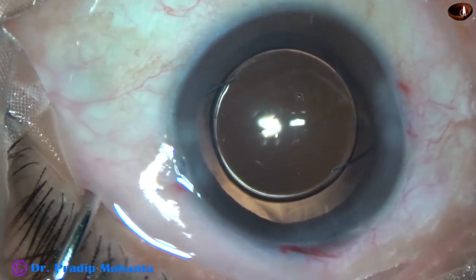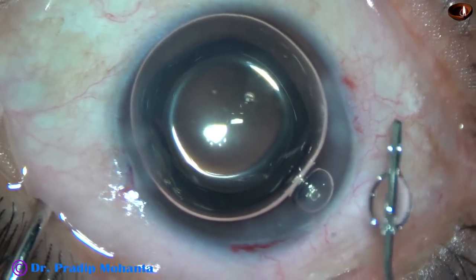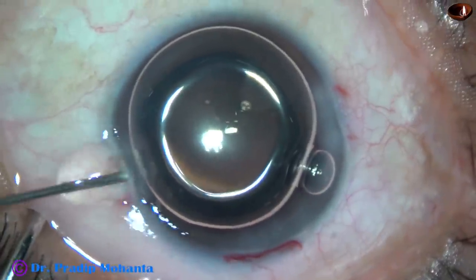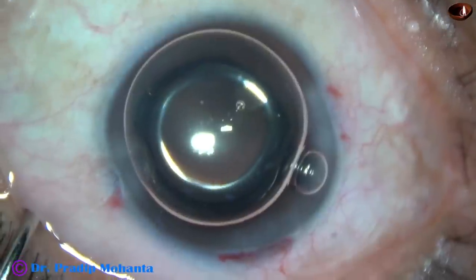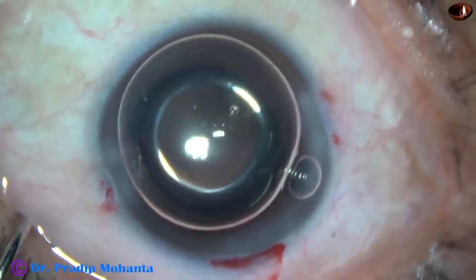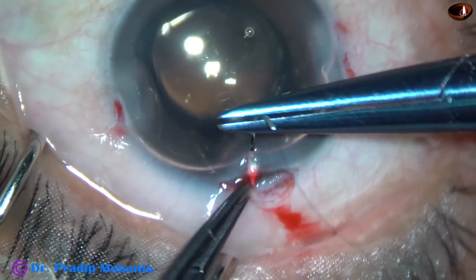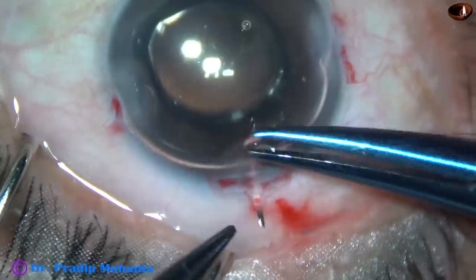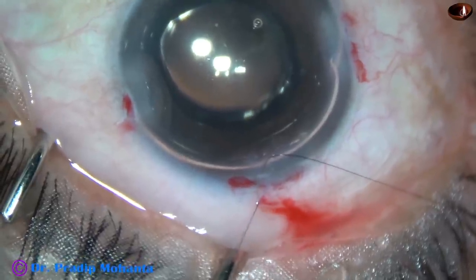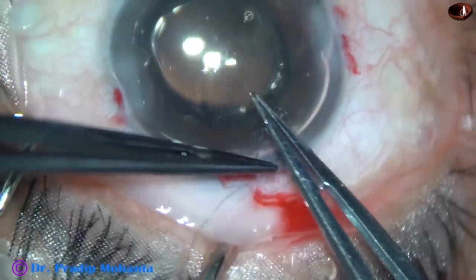This is where we are towards the end of the surgery. And now I inject to look up in order to test for any vitreous strand. A suture is placed at the main wound with 10-0 nylon. In this case, since I have enlarged the main wound after anterior vitrectomy, I must put a suture. This is how the suture is being placed — two loops and then one through.